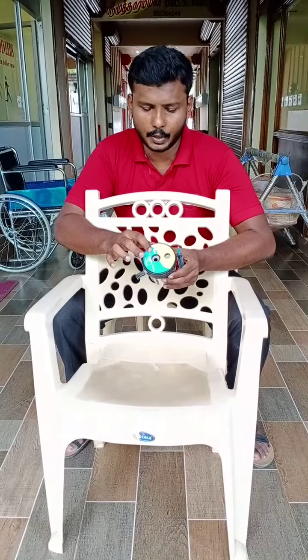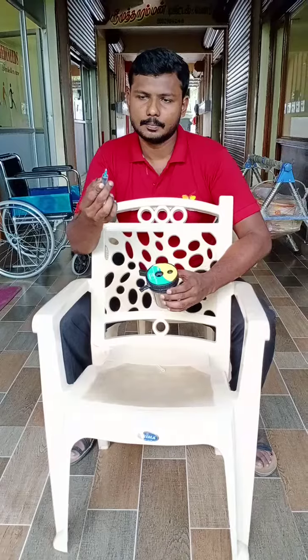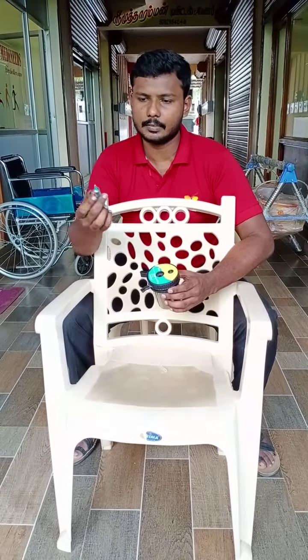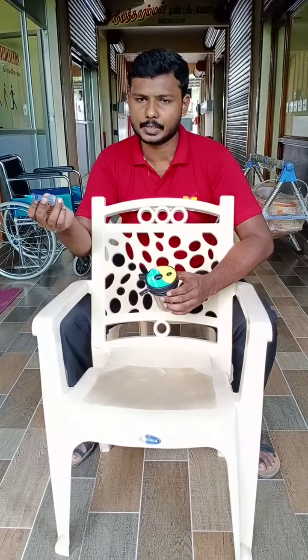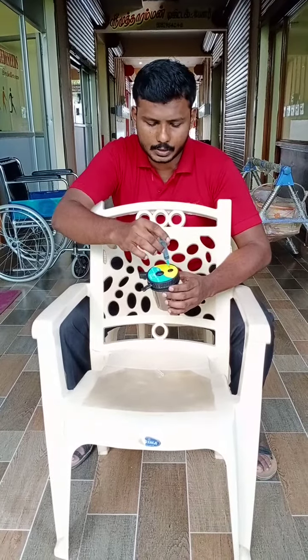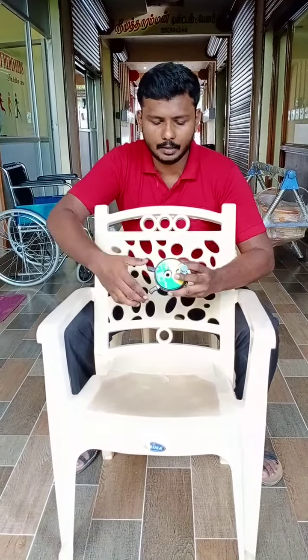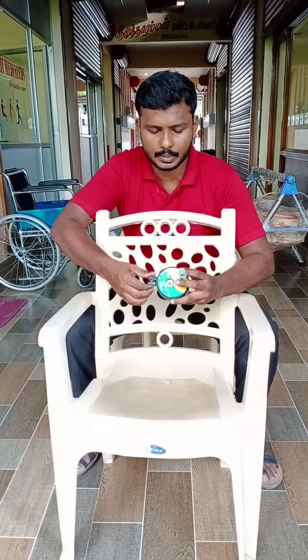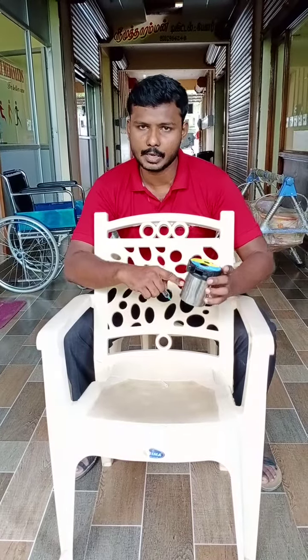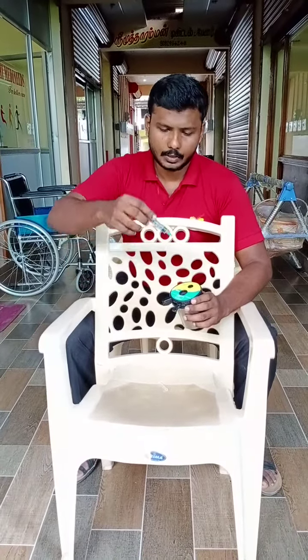Once you use this syringe for giving medicine to the patient, you will place this needle into the needle cutter port. Once you insert this needle, you will flip it — the needle will be cut down and it will be safely placed inside this container. Next, there is a barrel cutter port.